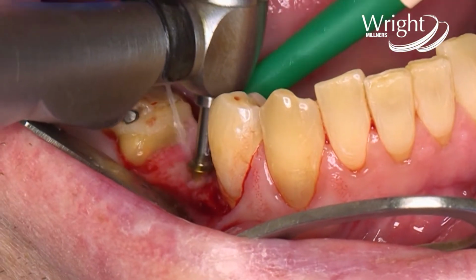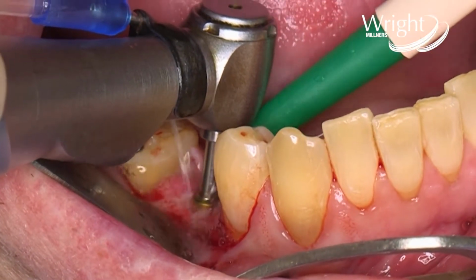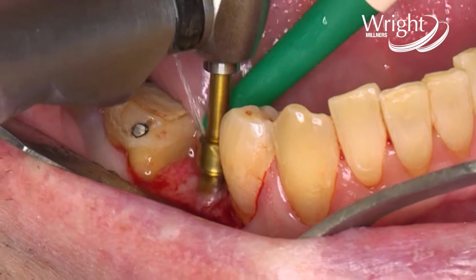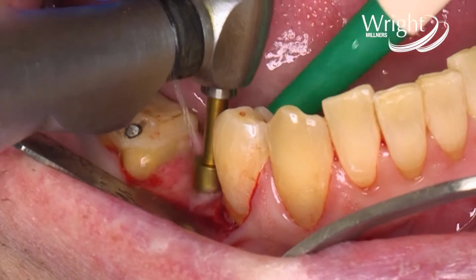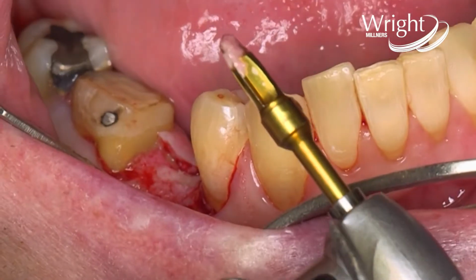Once again, this drill in the Megagen kit also comes with the stoppers. So it's not just the pilot drill, which the other systems that have stoppers do, they even go up to the core drill. So then we go to our core drill, which is a 3.3 drill. This correlates with the size of the implant we're going to place. Always still ensuring that my water is hitting the drill and cooling the drill. See the bone bits that come out of the drill? That's why the pump action.